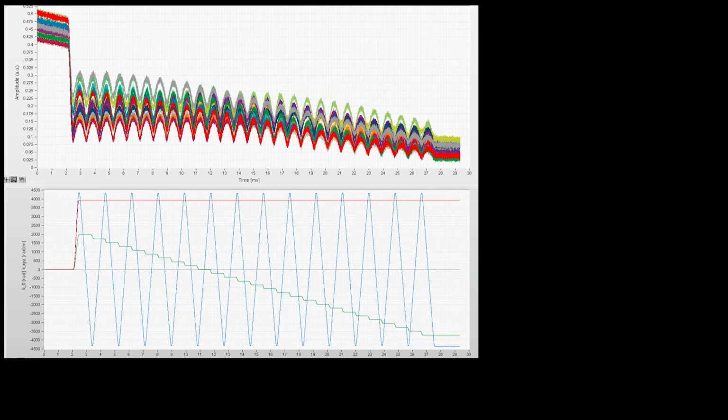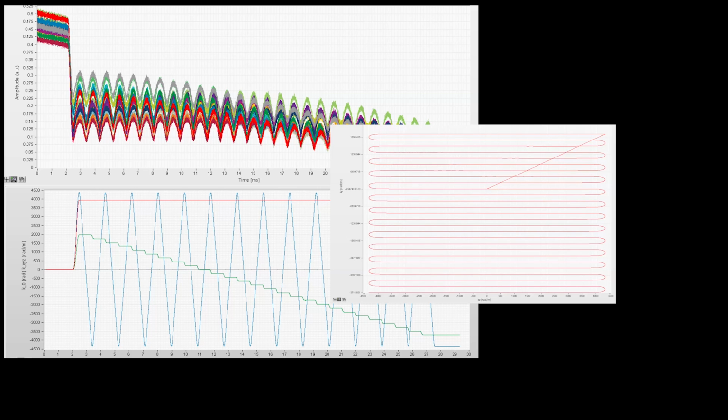Once we did that, we took out that transmitted signal, and now you can get really nice and coherent FIDs. And so the trajectories now look very good. Gabrielle and another postdoc in our group actually just completed this acquisition. I think it's completing today because we set this up on Friday night. And I think the trajectories now look consistently great.